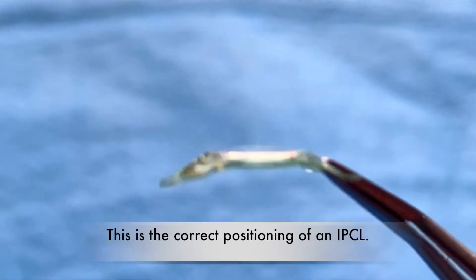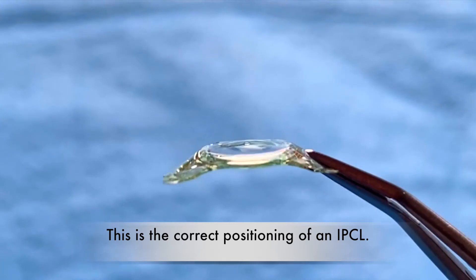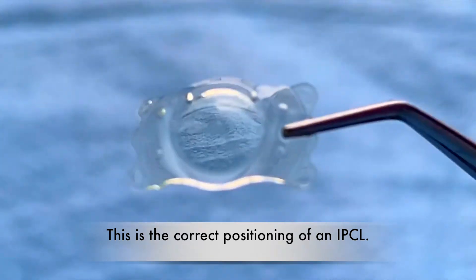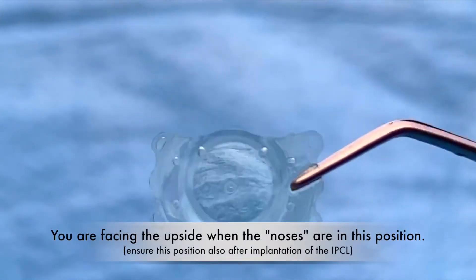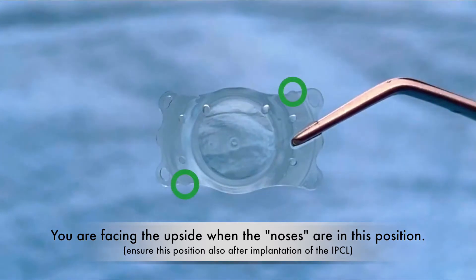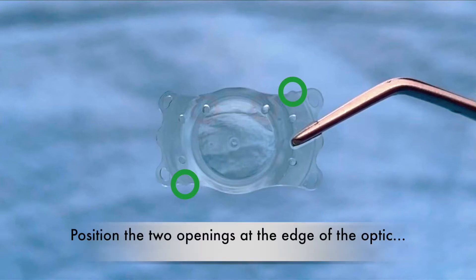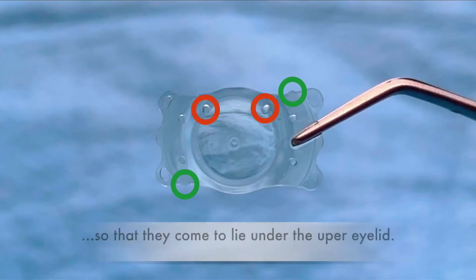This is the correct positioning of an IPCL. You're facing the upside when the noses are in this position. Ensure this position also after implantation of the IPCL. Position the two openings at the edge of the optic so that they come to lie under the upper eyelid.